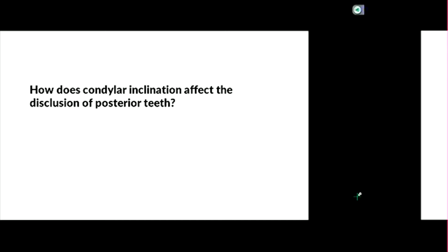The space increases, right? That makes sense because at 60, the slope is really steep, and as you go forward, your condyle needs to go down pretty quickly. And 60 would be the articular eminence slope? Yes. That number on the side represents our condylar inclination, which is the angle between our Frankfurt horizontal and the slope that your condyle travels down. So that represents basically the slope that's in your head, the articular eminence.